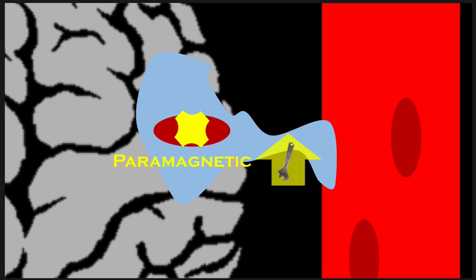So this here is our oxygenated hemoglobin. And within a few hours, that oxygen is going to begin to dissociate from the clot's hemoglobin. And when it does that, we make a change from being oxyhemoglobin to deoxyhemoglobin. And the main thing that's going to change there is now we have 4 unpaired electrons. And that is going to result in a change from being diamagnetic to paramagnetic, actually pretty strongly paramagnetic.